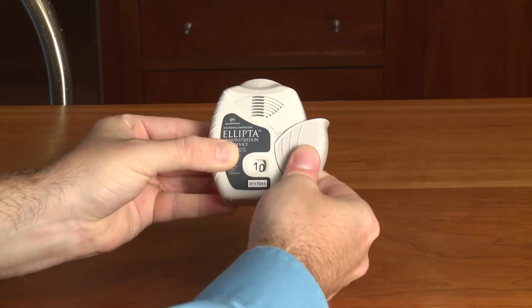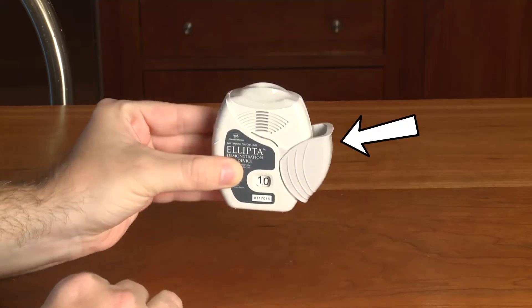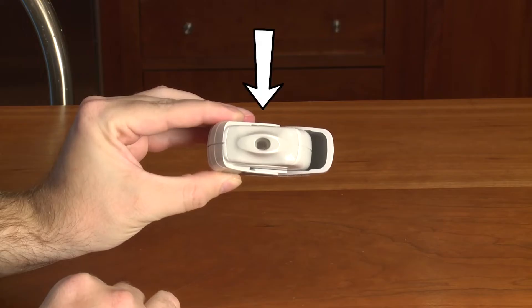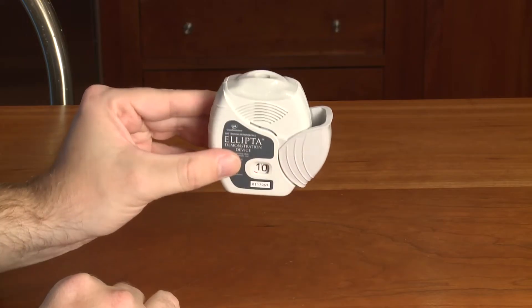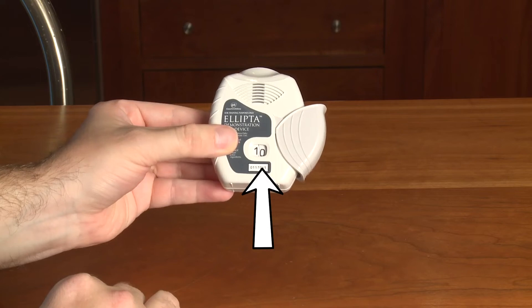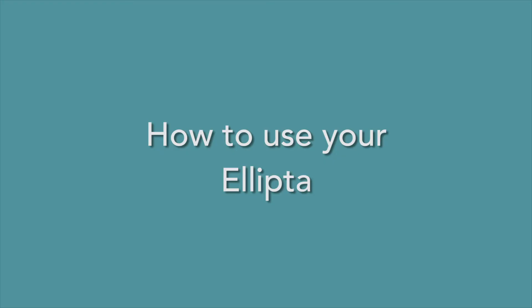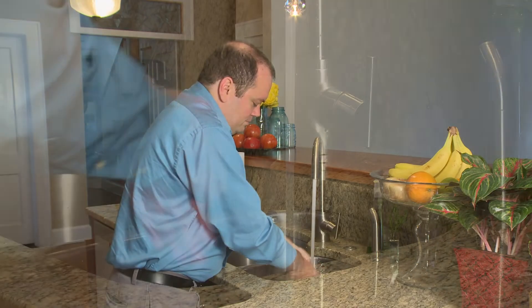The Ellipta holds the dry powder medicine. When it is closed, the cover keeps the mouthpiece clean. When you flip the cover open, it gets your medicine ready. The mouthpiece is where you breathe in the medicine. The counter keeps track of how much medicine you have left in the Ellipta. The air vents help you get your medicine into your lungs.